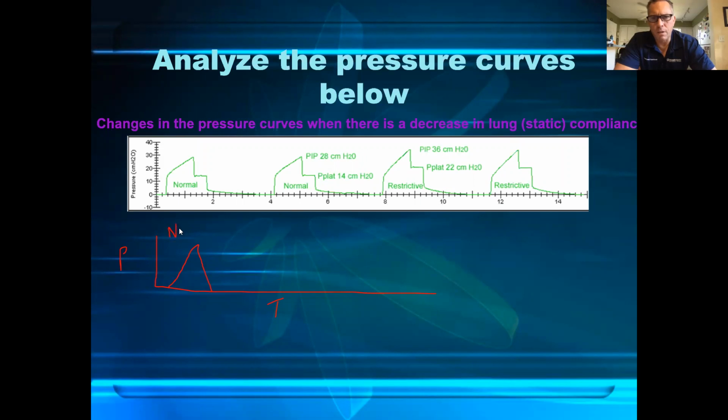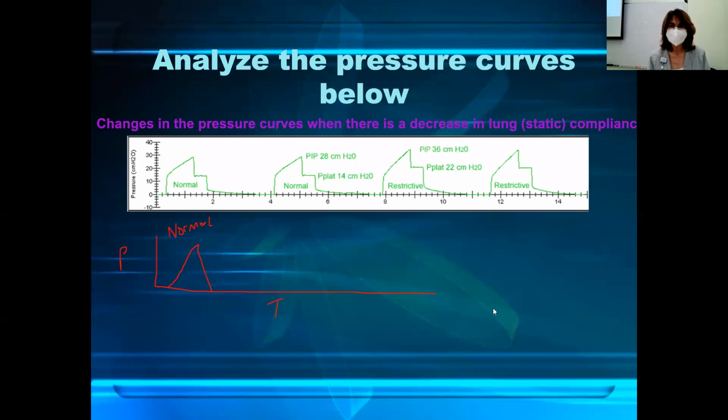I thought a normal breath would have more of an inspiratory plateau before expiration. So you're looking at patients on a pressure mode of ventilation, and that's why you're seeing that. Probably PRVC is being used a lot at the institution where you work. Maybe, yeah. So that's a pressure breath, and pressure builds up immediately at the very beginning.